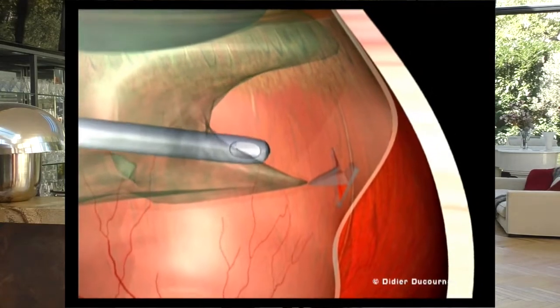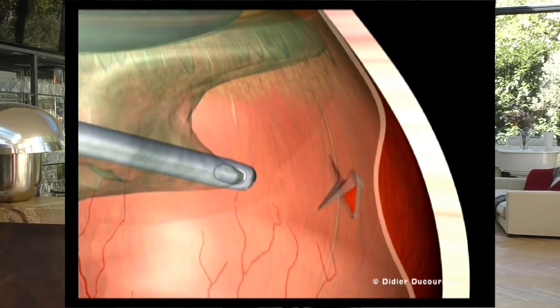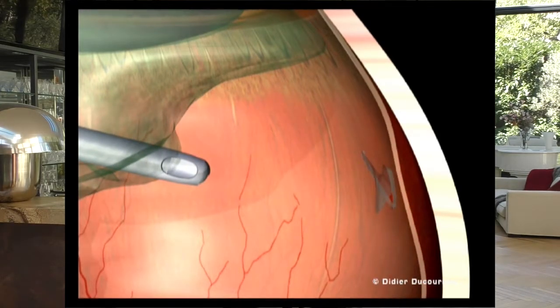If we now study vitrogenic detachments, is the identification of vitreous traction an indication for vitrectomy? One would be tempted to think so, since the vitrectomy section of the vitreous traction will definitively treat this traction, while the indentation only relaxes it.